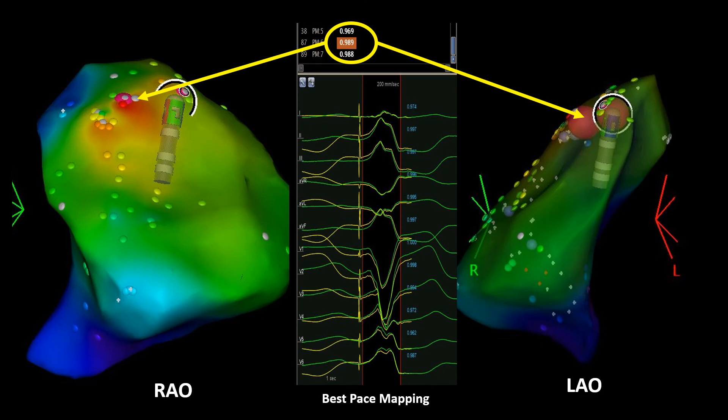Here we see the three-dimensional mapping of the RVOT in RAO and LAO projections showing the earliest point, the best pace mapping, and the successful ablation site at the posterior part of the RVOT free wall.